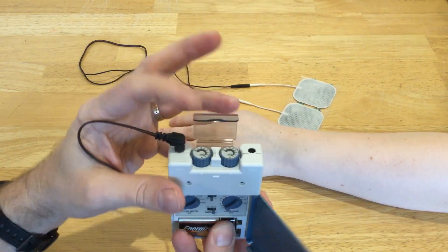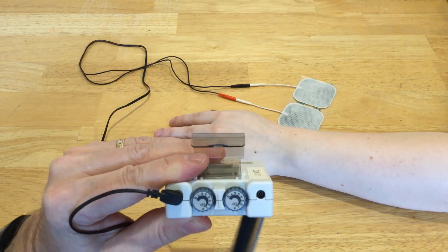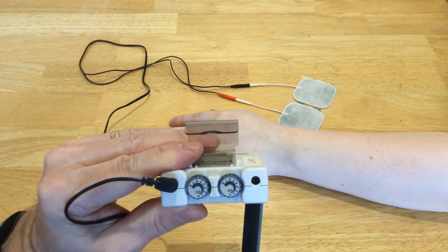On top is where you will actually turn it on and then increase the intensity using the dials there.